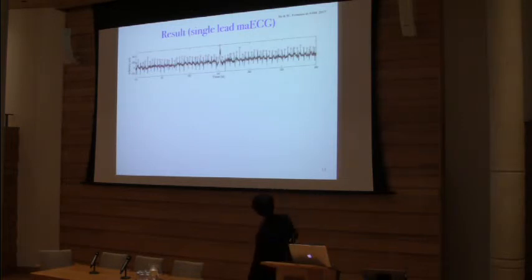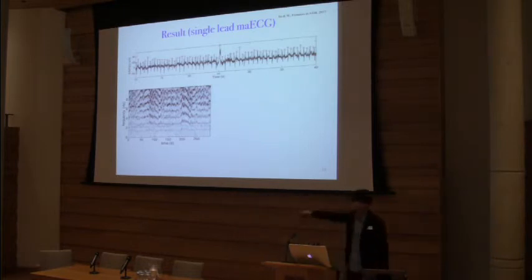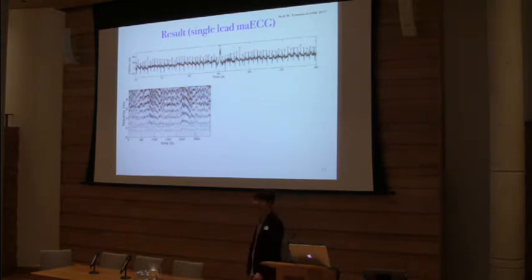This is the maternal abdominal ECG. As promised, if you take a look at the short-time Fourier transform, it's almost impossible to tell too much, right? You get a lot of quantities, and the major component is concentrated at 8 Hertz.